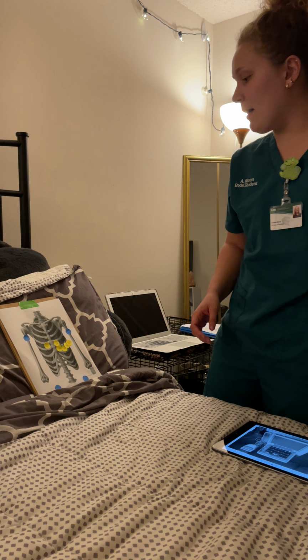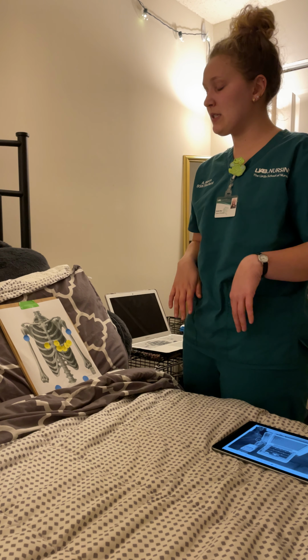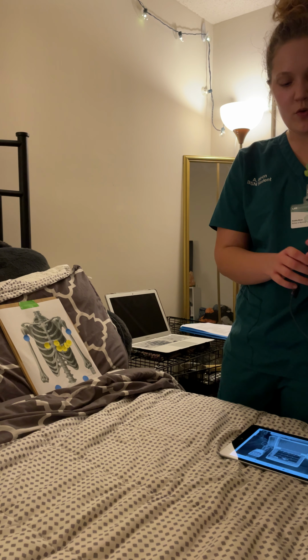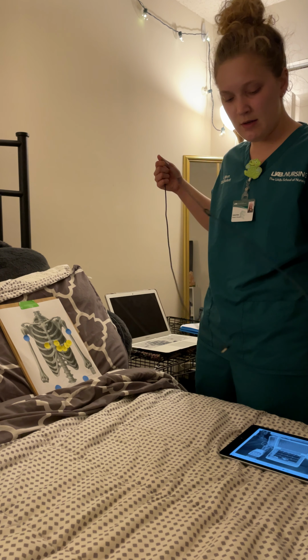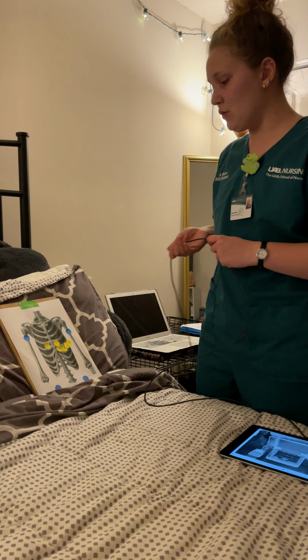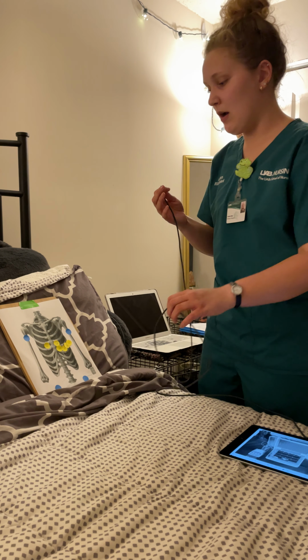So Miss Gee, you can breathe normally. I'm just gonna have you stay very, very still. I have my EKG machine. Now I'm going to attach my electrodes to the wires.